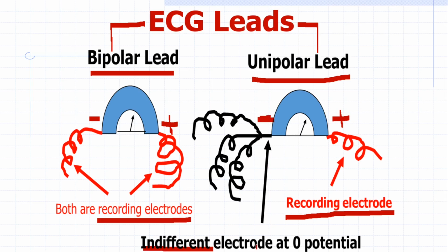So this indifferent electrode is kept at zero potential. This is the reference potential.